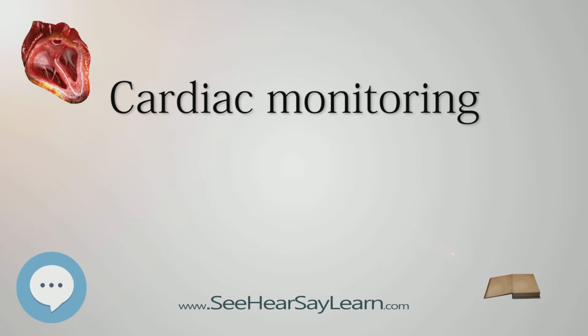An example of automatic monitoring is the transtelephonic cardiac event monitor. This monitor contacts ECG technicians, via telephone, on a regular basis, transmitting ECG rhythms for ongoing monitoring. The transtelephonic cardiac event monitor can normally store approximately 5 cardiac events, usually lasting 30-60 seconds.